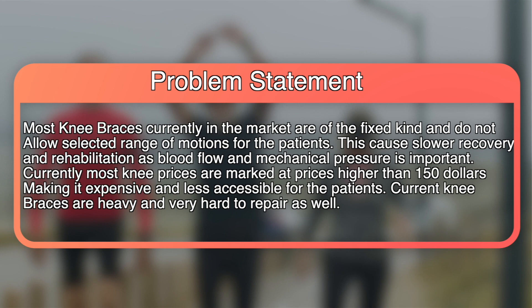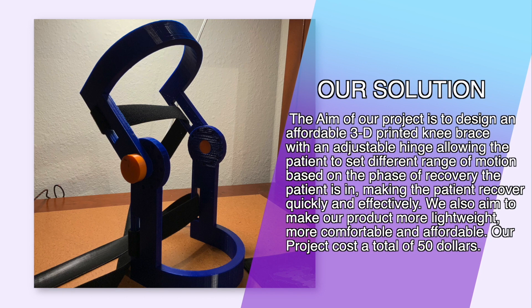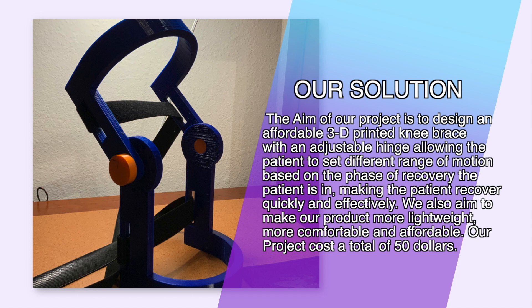Our solution is to design a 3D printed brace with an adjustable hinge, allowing the patient to set the range based on the phase of the recovery they're in. We also wanted it to be lightweight, easy to repair because it's 3D printed, more comfortable, and affordable with a cheaper price range around $50.